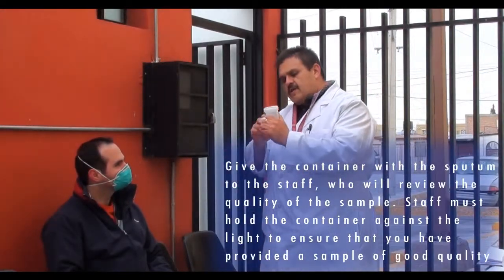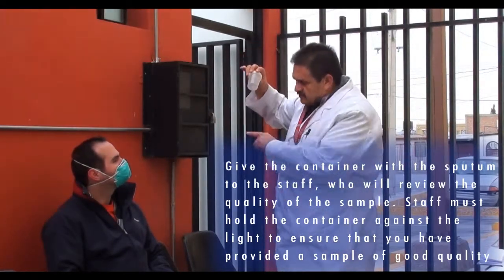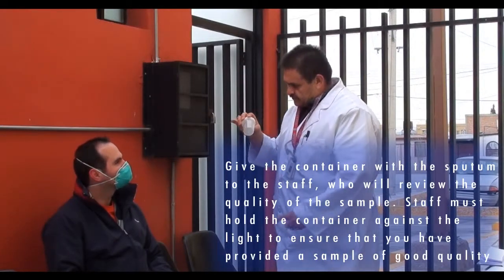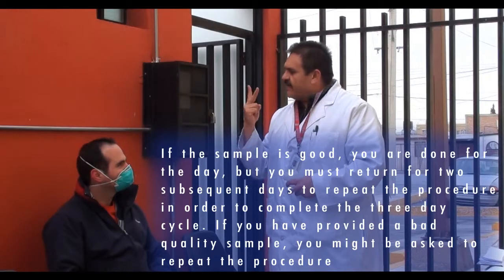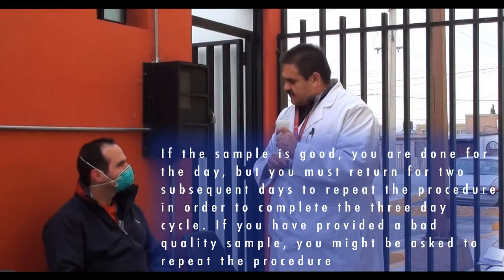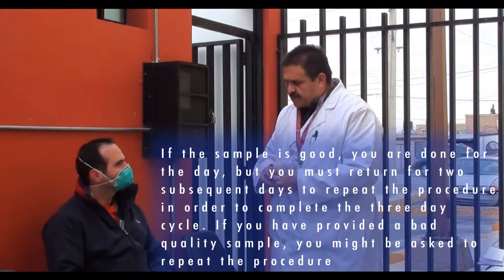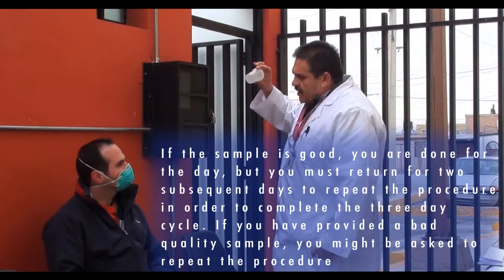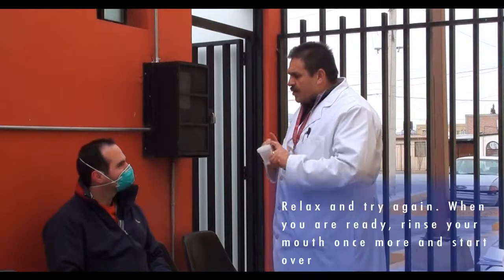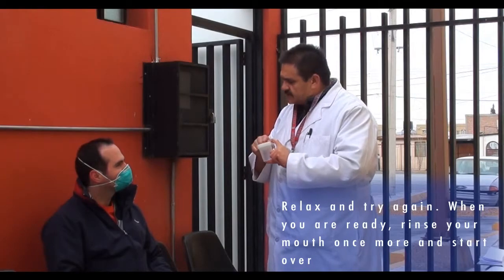Give the container with the sputum to the staff, who will review the quality of the sample. Staff must hold the container against the light to ensure that you have provided a sample of good quality. If the sample is good, you are done for the day, but you must return for 2 subsequent days to repeat the procedure in order to complete the 3-day cycle. If you have provided a bad quality sample, you might be asked to repeat the procedure. Relax and try again. When you're ready, rinse your mouth once more and start over.